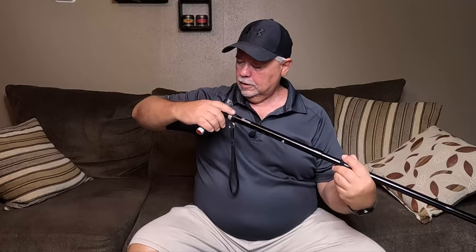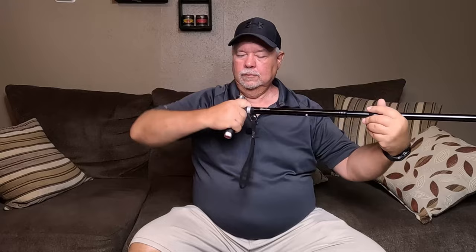I forgot to mention this does have little finger grips right here where you can hold it, wrap your fingers around like that. And if you needed to, there's this little wrist strap right there to give you a little added security. Well there it is — there's the Bean Cane walking cane.